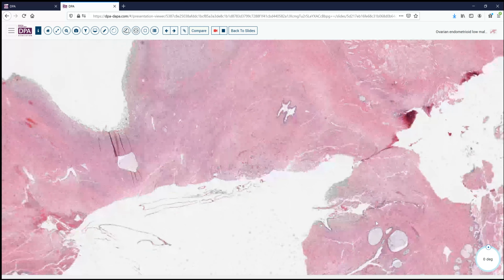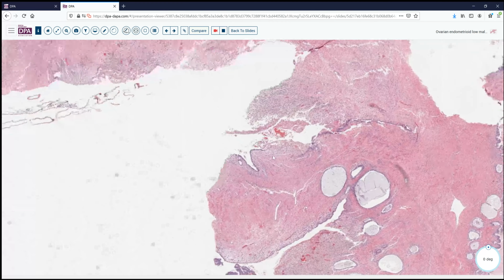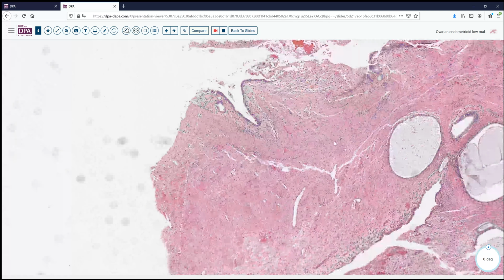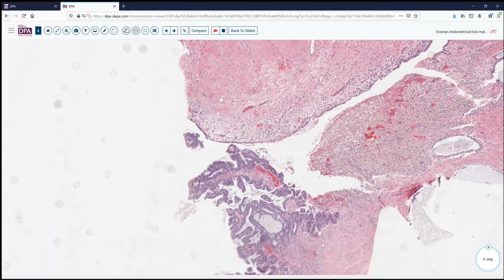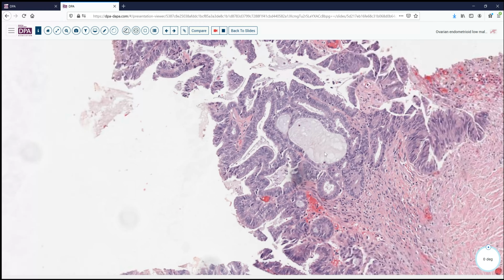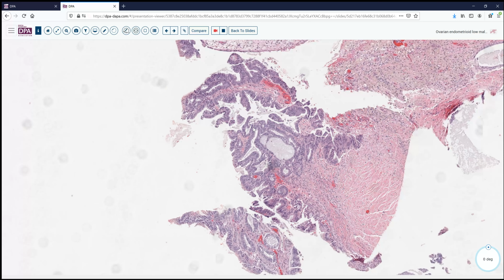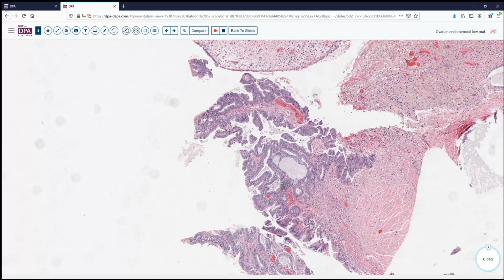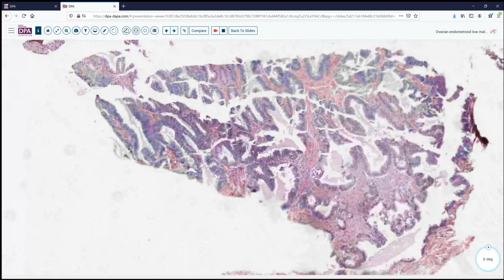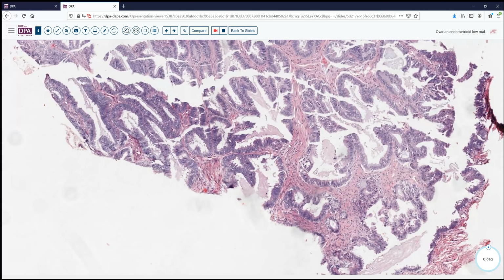And then looking at these other areas, again, we see a little bit of endometrioid type tissue here, maybe some stromal type tissue. And then look here, we have a little bit of atypical proliferative pattern, glandular crowding, moving into the hyperplastic atypical hyperplasia realm with some papillarity and architectural complexity. Here's more of that. Again, we see some intervening stroma, but we're seeing tufting of the epithelium.